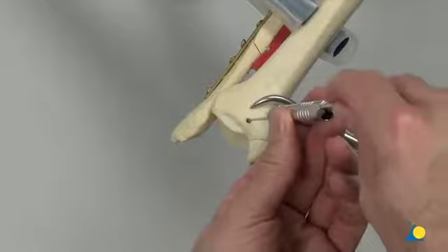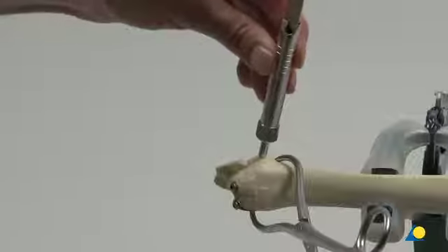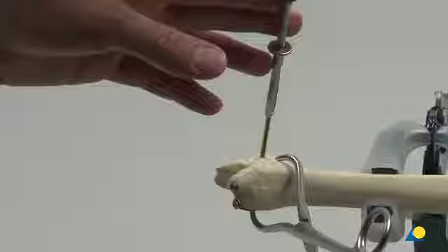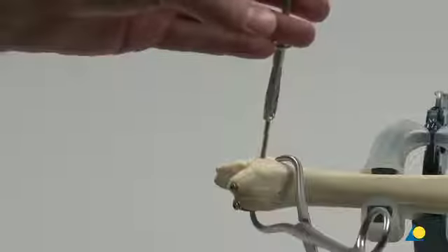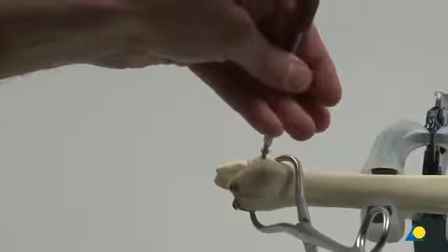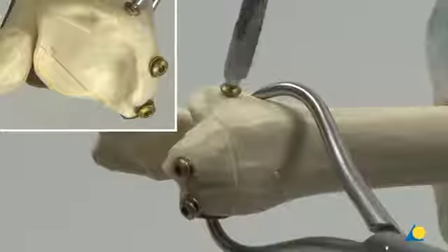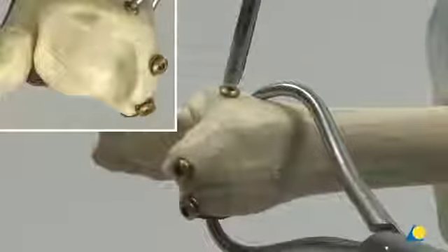The depth gauge is used to measure the required length of the screw. The hexagonal screwdriver is used to insert the 3.5 mm self-tapping cortical lag screw. The compression effect is clearly visible at the fracture line.